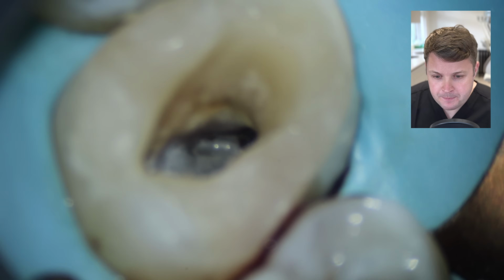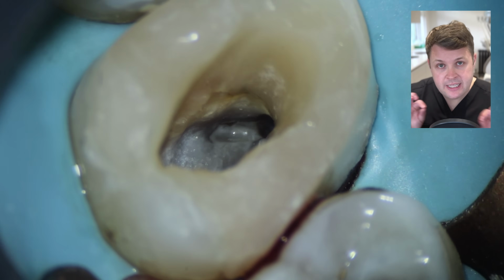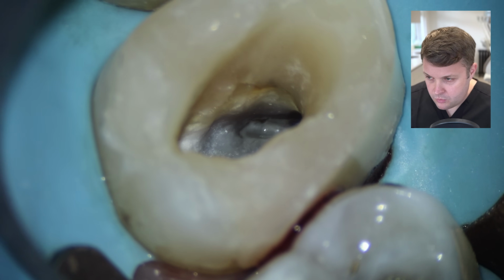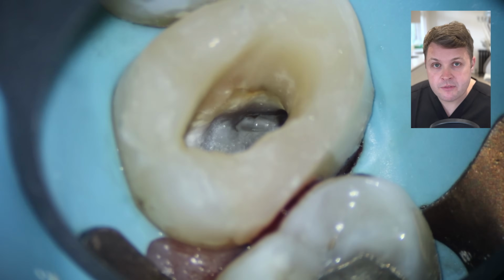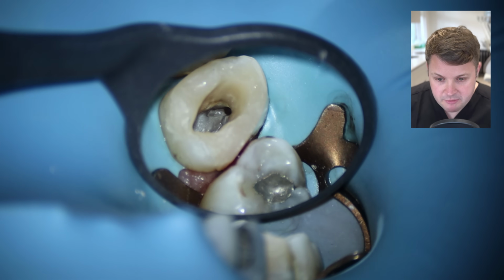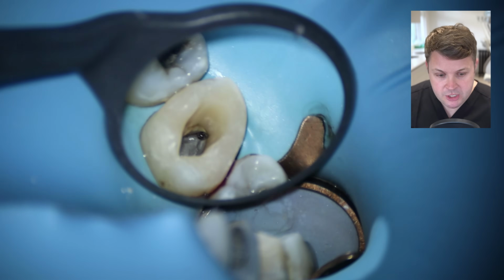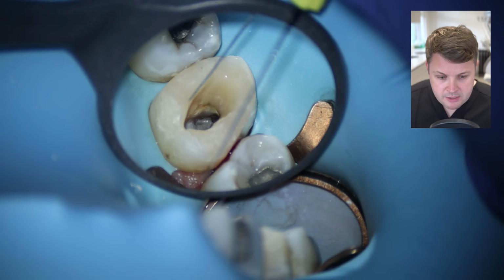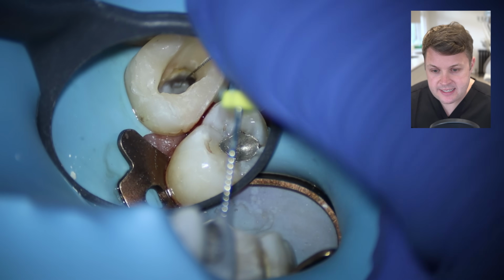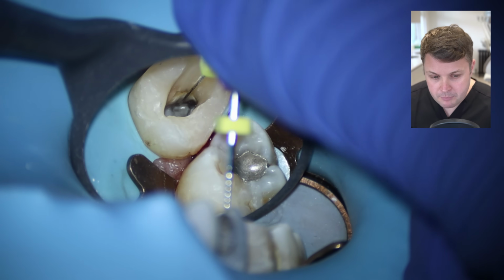We can see here that there's an orifice, and you need as much straight line access as possible, because if you don't remove that dentin shelf, if you have that kind of overhang of dentin or enamel or the restoration that you've placed on it, it's going to be really, really difficult for your hand files to reach all the way to length. So in the first instance, I'm going to try and negotiate the MB2 with a size 10 K file. Again, it's the same protocol.